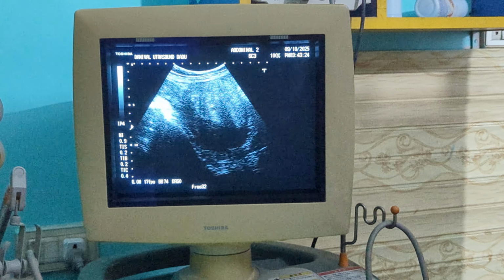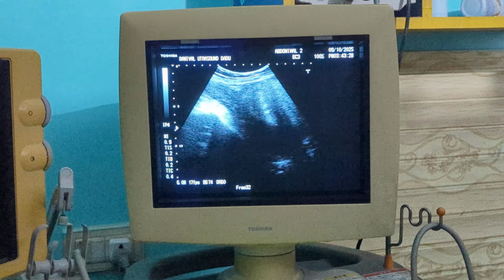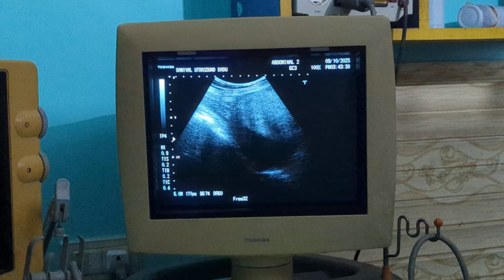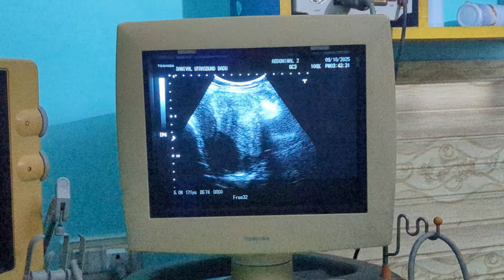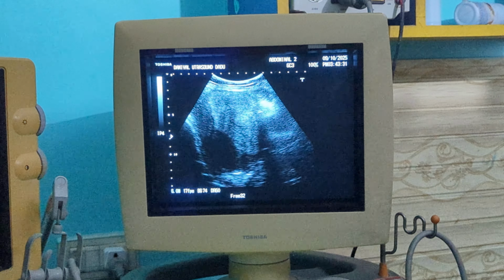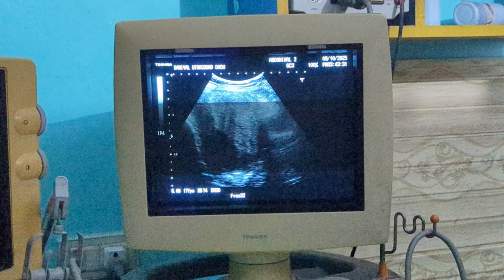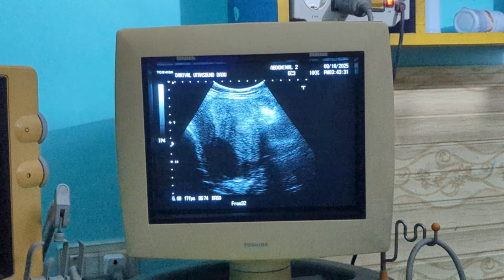And could it be a pedunculated subserosal fibroid with calcifications? And the third DD is usually a post-surgical or organizing inflammatory mass, but there is no such history of operation.